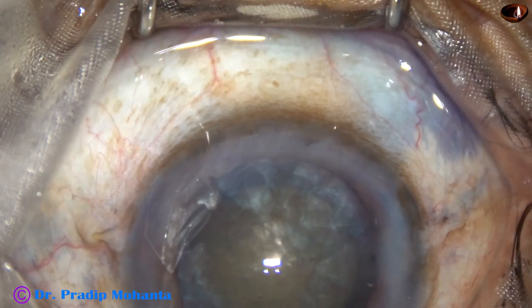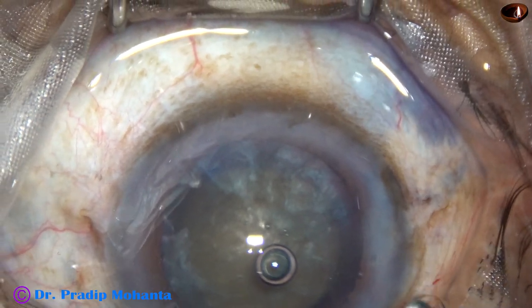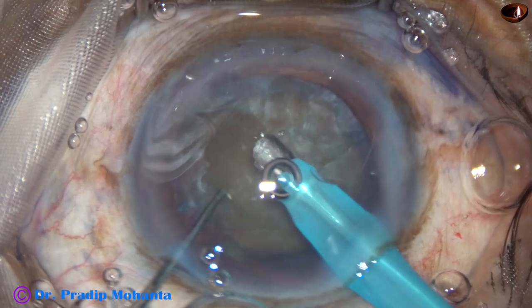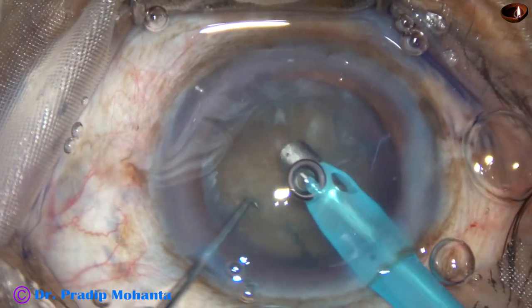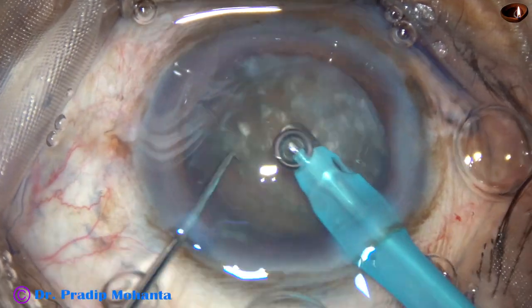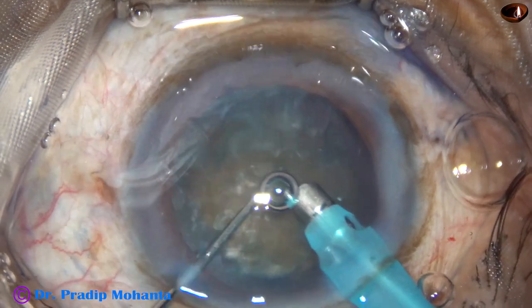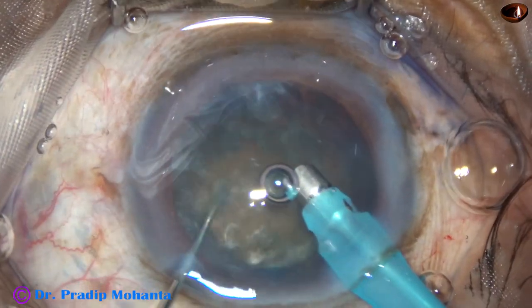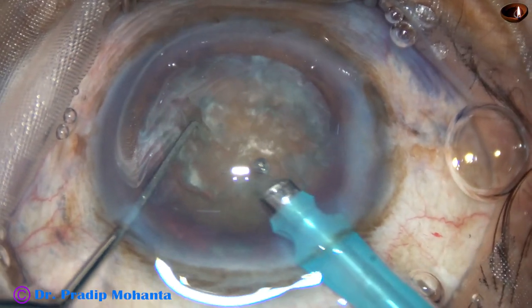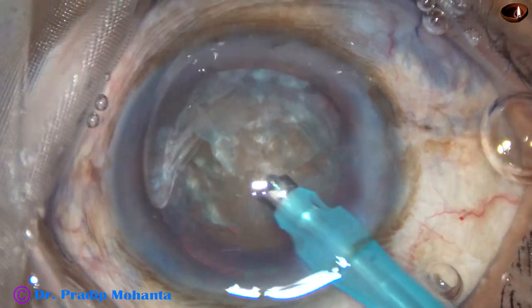Now viscoelastic is injected again. We have not rotated the nucleus well, so irrigation is used and some superficial cortical lens matter is removed. Then I am trying to rotate the nucleus, and the irrigating fluid from the handpiece itself is being used to hydrate the equatorial region of this cataract. The nucleus has rotated.